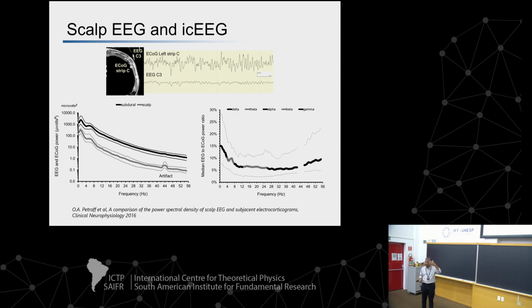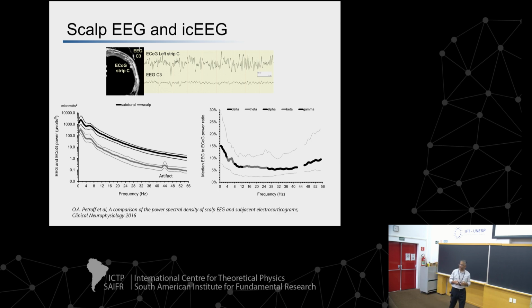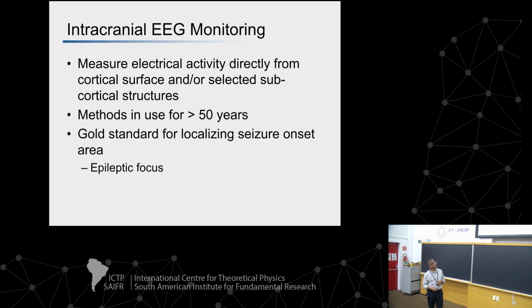So Klaus, for example, yesterday had a capture of seizures that was quite long and didn't have noise in it. Otherwise, that person was possibly, at some point, going to develop movements, and that does not necessarily contaminate the intracranial signal. But the magnitude can be quite large, and it does impact the scalp signal. So we focus on the intracranial signal, and as you can see from this example up here, it's not just the amplitude, it's a much richer signal in terms of its broadband spectral content, much broader than the scalp signal, and carries a lot more information.